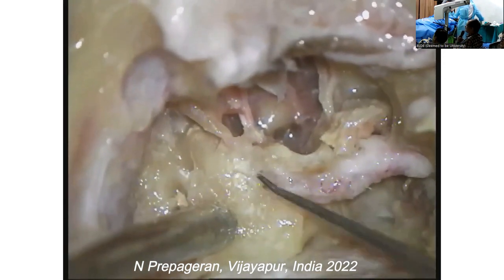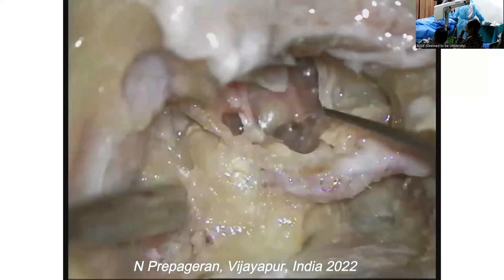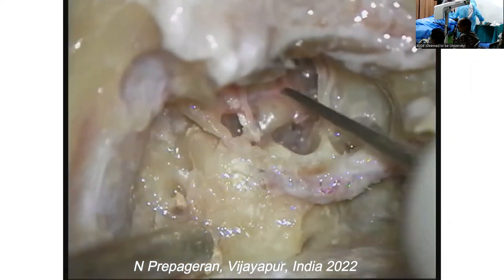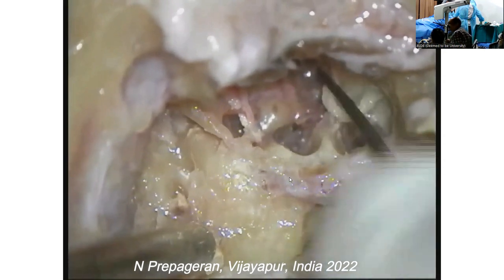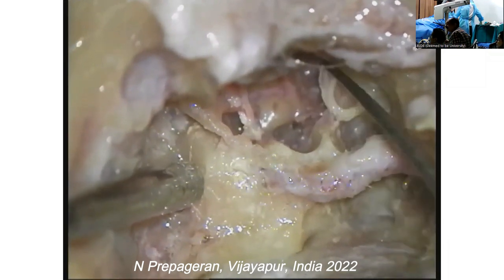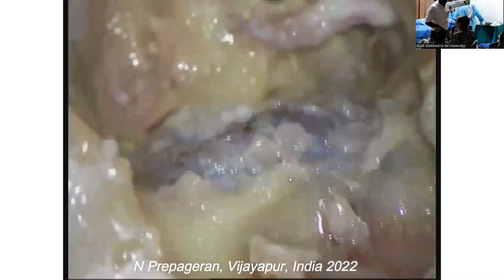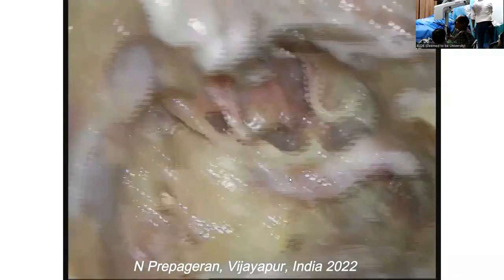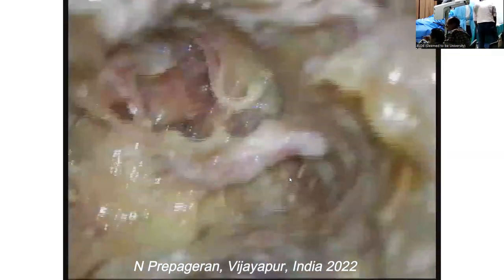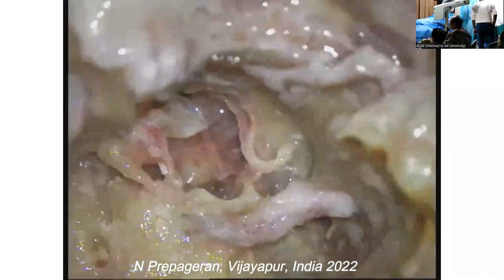During tomorrow's cochlear implantation demonstration, this is going to be a very important point. Here you can see very nicely that's your Jacobson's nerve, Arnold's nerve. Can you see that? About cochlear implantation, we'll be talking tomorrow. I was showing them this becomes important: post-implant, we have to identify this.